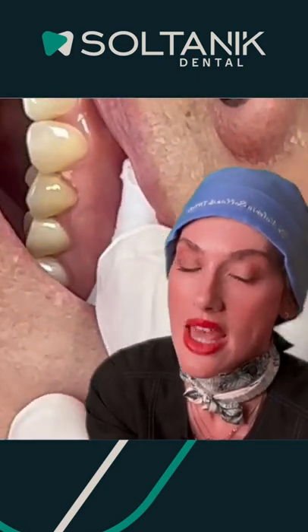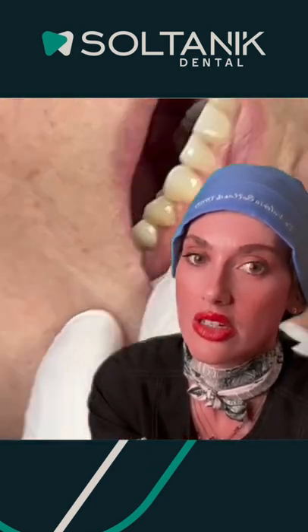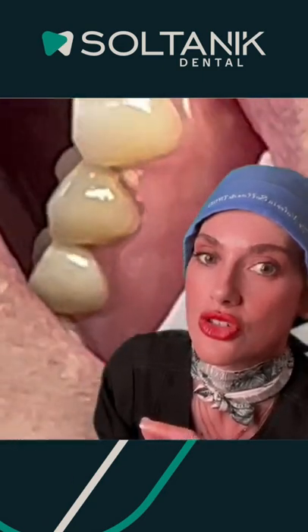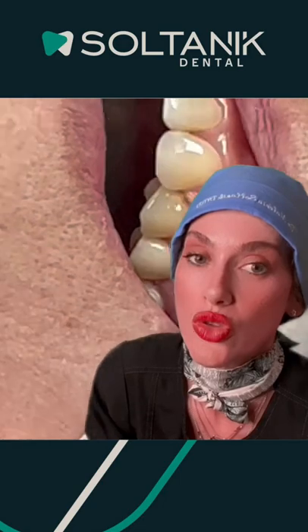The two crowns were cut as the patient waited, and then with special coloring — you cannot even see the color — he's such an expert that he's giving special shading to the crowns so they look just like the other teeth.